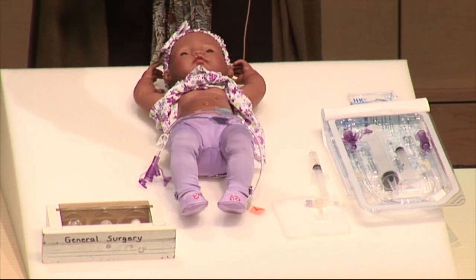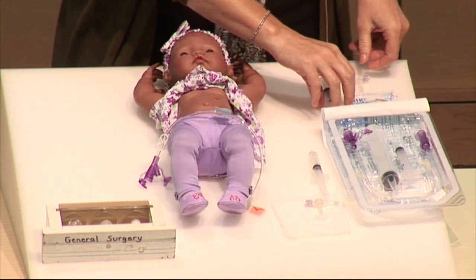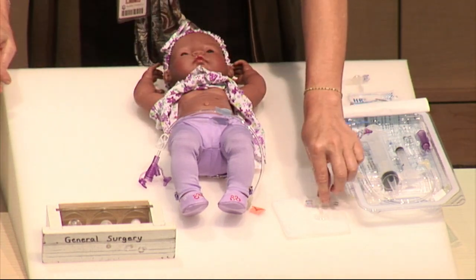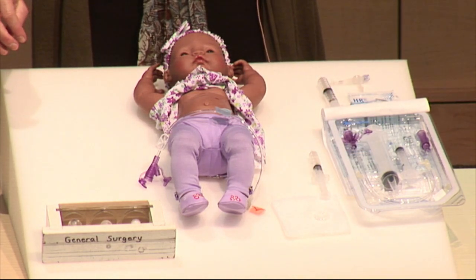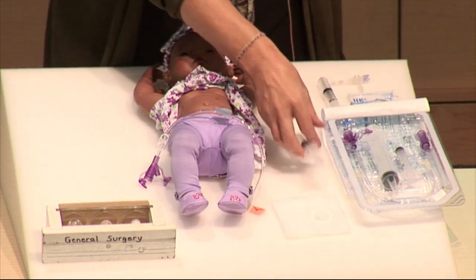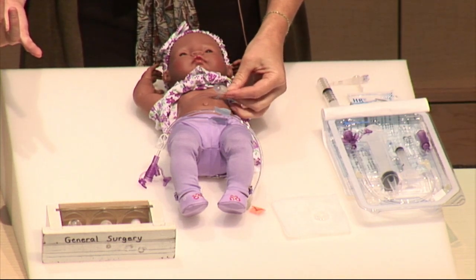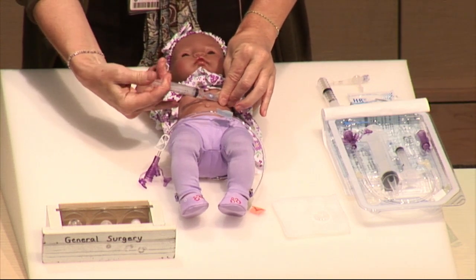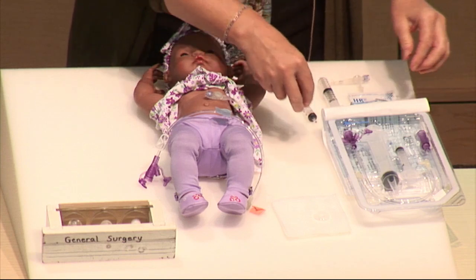Now, if there's food in the tummy right now, it is going to start leaking out. That's okay. I usually have a towel or a washcloth here and cover over the hole. We reach over here to your new tube that's all pre-lubed. I hold it in my supportive hand, put my water syringe in the dominant, wiggle this right in, hook this up, blow up the new balloon. Done. Now you have to check placement.